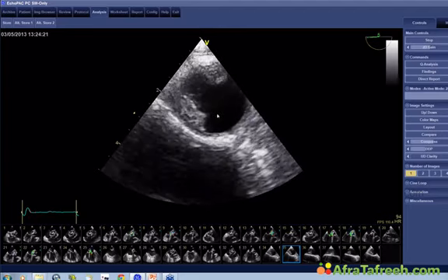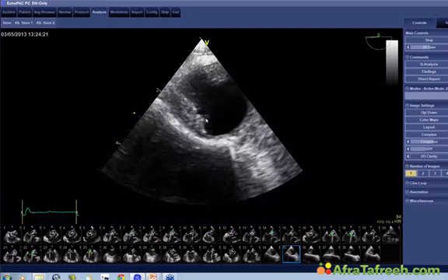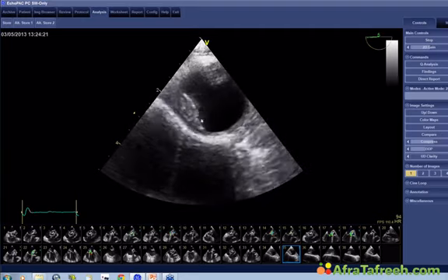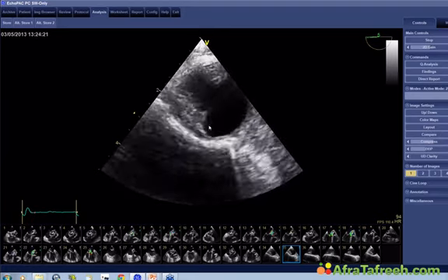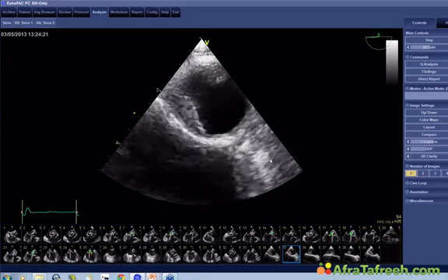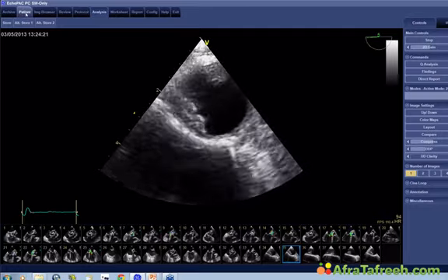This might be a plaque, but with the mobile structure on the aorta, on this plaque or whatever it is, there is high suspicion that there is infection as well of the aorta. So this is, in my view, endocarditis of the aorta as well. Remember, endocarditis only means that the endocardium is infected, and it could very well be the endothelium of the aorta as well. And with this massive infection of the aortic valve, probably bacteria are brought downstream, and there seems to be a plaque here, and this plaque is kind of superinfected, I would say, and we have a vegetation here. What was the outcome of the patient?